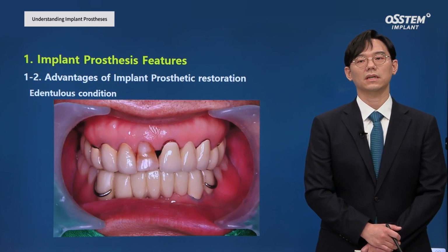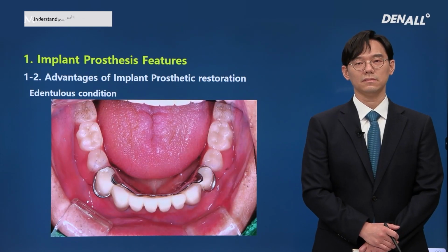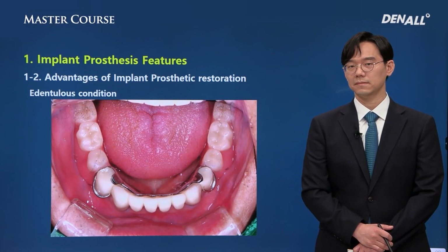In the conventional way, RPD was fabricated and delivered. This is an intraoral photo.